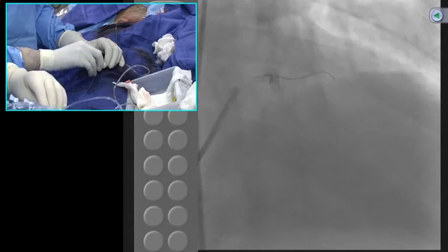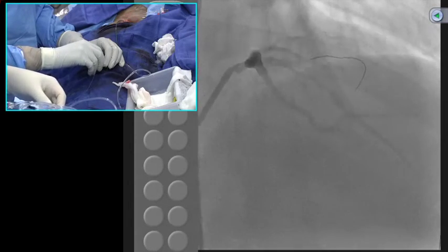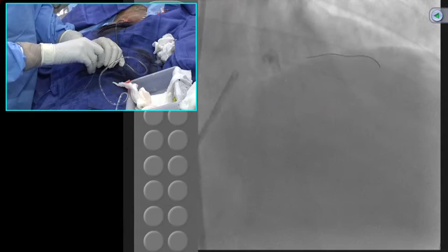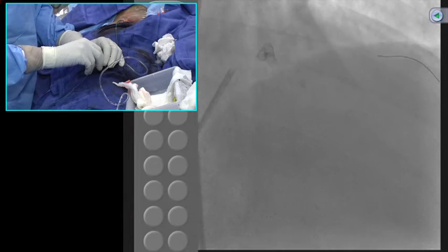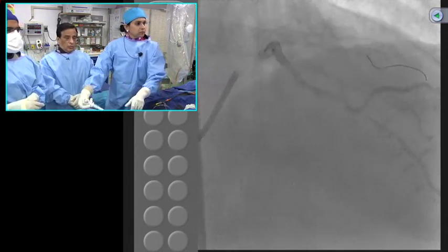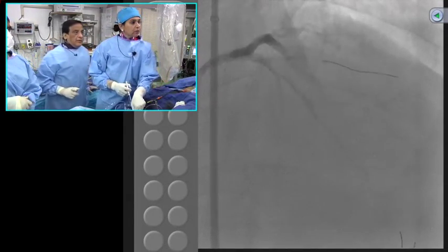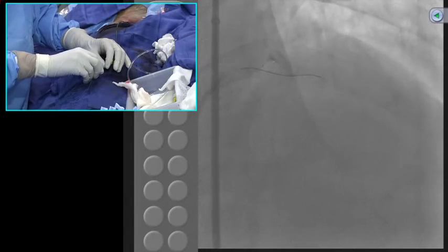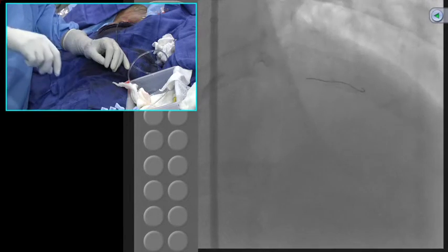So, Samin, there are two more questions related to the drug-eluting balloons. In 2015, if a patient comes to you with restenosis of either a bare metal or a drug-eluting stent, your choice is going to be a newer generation DES? I would say up to a second or maybe third layer. Yeah, and maybe the one difference would be if the patient cannot take dual antiplatelet therapy for a long time. In that case, my threshold to go to a drug-eluting balloon will be lower, rather than putting in a restent. Clearly we know that in all these trials, your restent did better because almost 70-80% of patients continued DAPT for a long period of time. So if there is a question about continuation of DAPT, then to me that will be the case where the drug-eluting balloon will be useful.